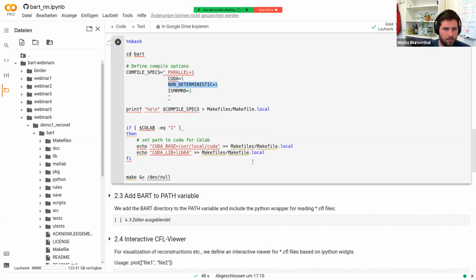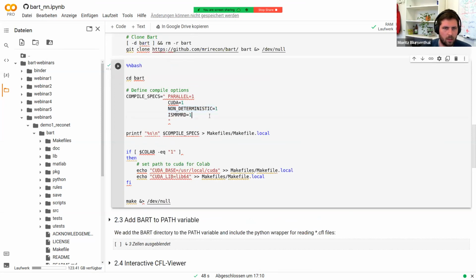Yeah. So is that something that you recommend users set to 1 always if they're not concerned about exact reproducibility? Yes. So I would suggest that, but I can guarantee if you use it and use convolution that your results are not expected to be bitwise reproducible. But if you set it to 0, there's no guarantee that it is bitwise reproducible because there might be other operations which are not turned off by setting that to 0.